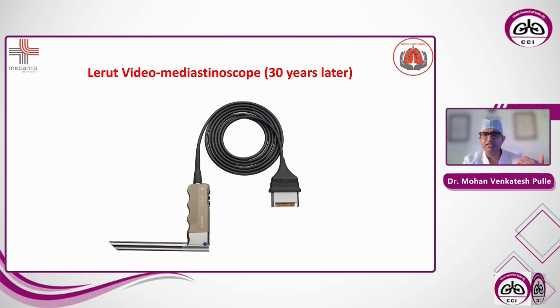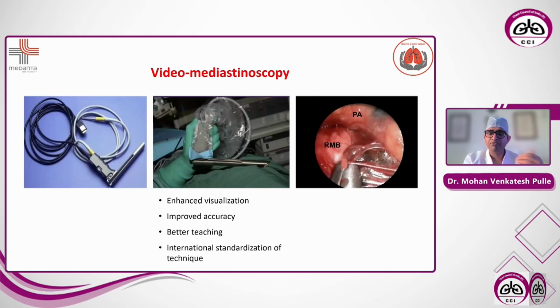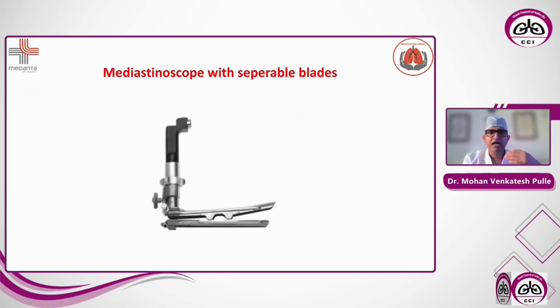Then 30 years later, Lerut connected a video to the mediastinoscope, which became the video mediastinoscope, where the visualization is better, accuracy is better, you can teach juniors better, and there is standardization of the technique. In the earlier days, only the surgeon could see what was happening inside the mediastinum, but now everyone can see it, so better teaching and standardization of technique is possible.